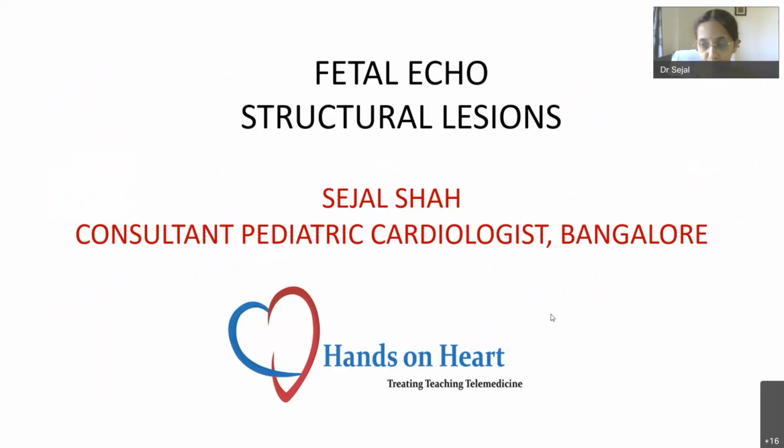Last session on fetal echo. We had the previous 4 sessions. Today we are going to talk about structural lesions. I think it is a vast topic, and so we will be probably focusing on only a few things today.